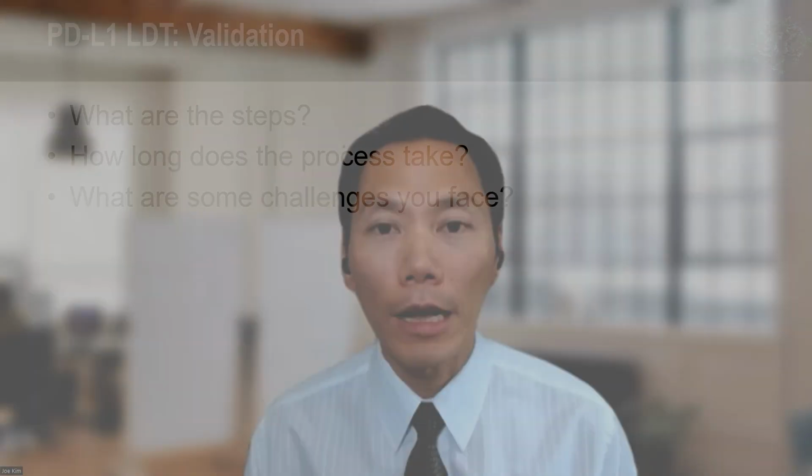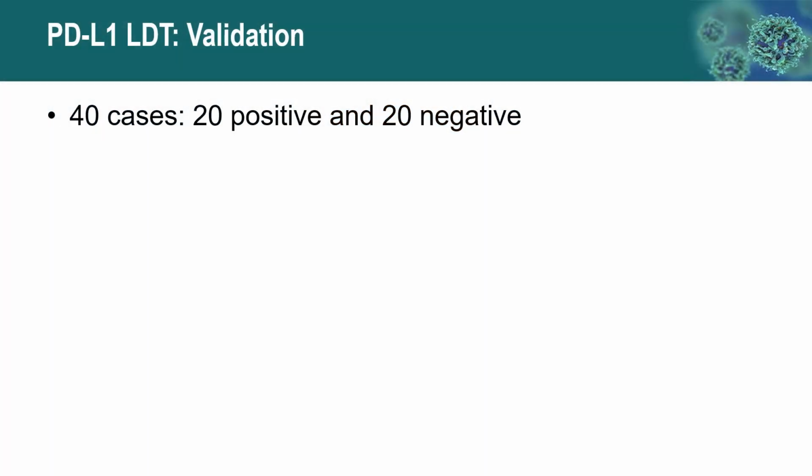What are some of the challenges? Ideally, the steps will be to test a large number of cases. In terms of CAP guideline, we're talking about 40 with 20 positive, 20 negative. But of course, for PD-L1, we're talking about gradations of a range of different expressions. And because we want to compare our LDT with what was already done with a companion diagnostic, so that we can compare head to head. And so that would be the plan.